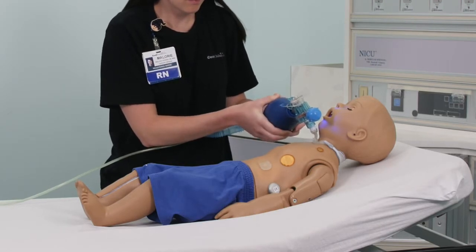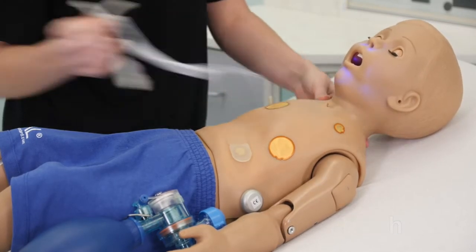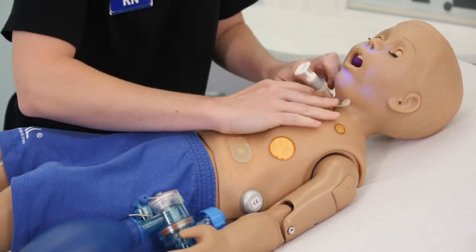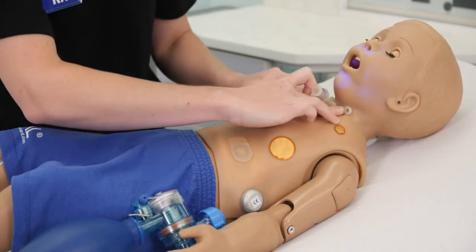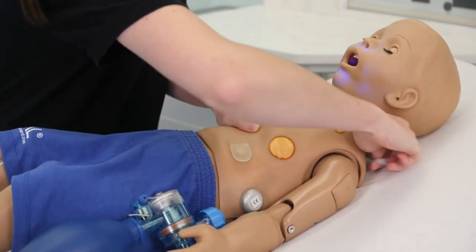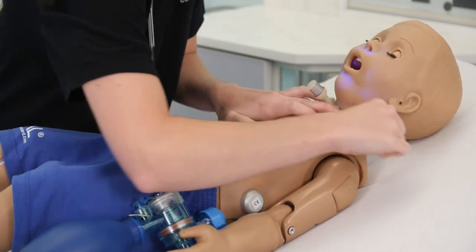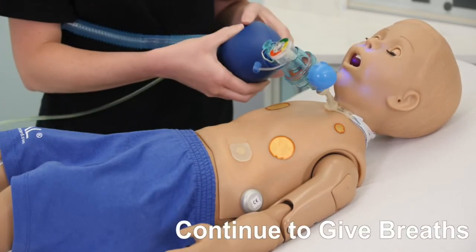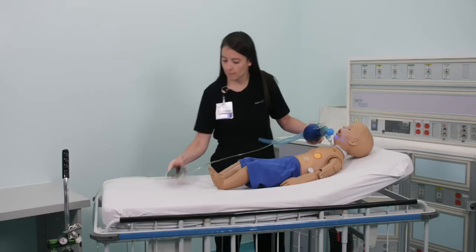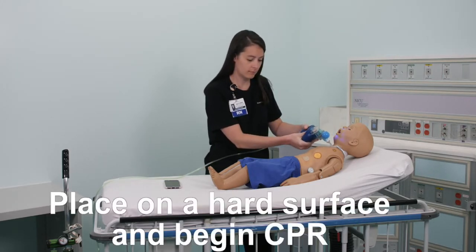If the child does not quickly respond, change the trach. Continue to give breaths with the ambu bag and call 9-1-1. If the child does not quickly respond or becomes gray or lifeless, place them on a hard surface and begin CPR.